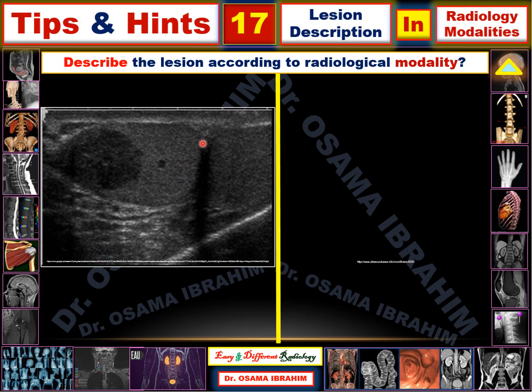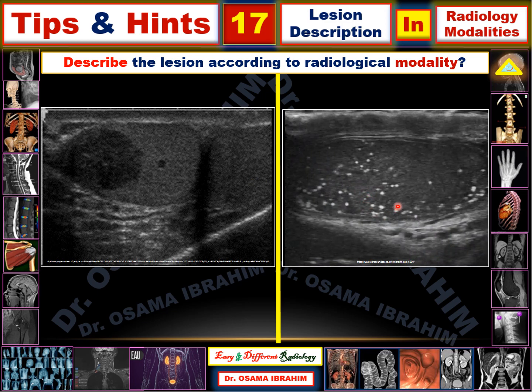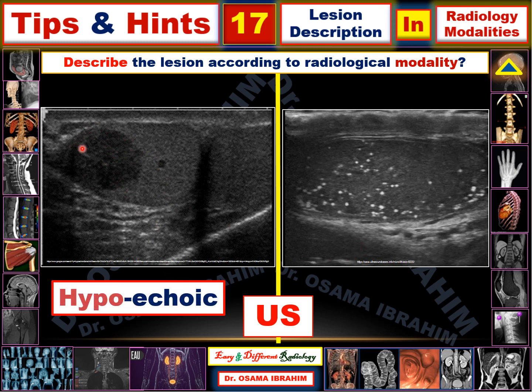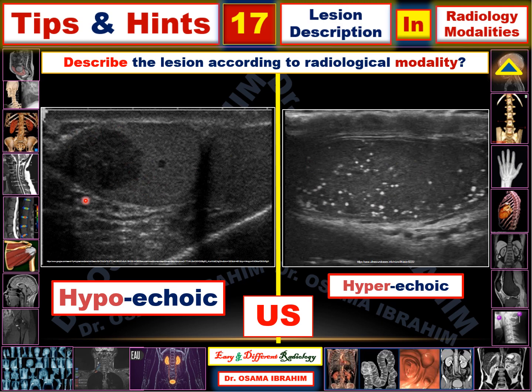We should always use the proper radiological term according to the imaging modality. Here the modality is ultrasound, so we describe lesions according to echogenicity. This lesion has low echogenicity and is described as hypoechoic. These multiple bright lesions are described as hyperechoic — for example, testicular microlithiasis versus a testicular tumor.